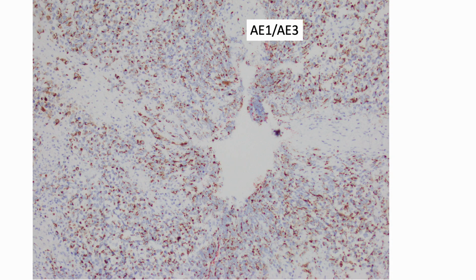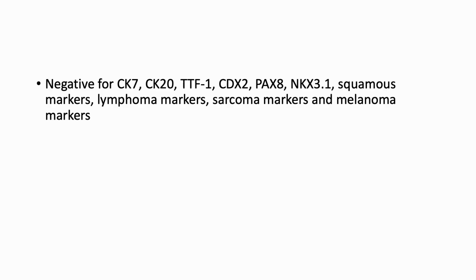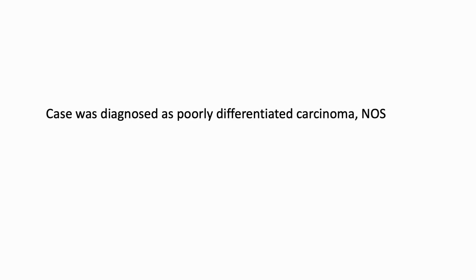This picture shows positive AE1/AE3 staining. We see perinuclear positivity with AE1/AE3. CAM5.2 is also positive, and showed a similar perinuclear staining pattern. The tumor cells are negative for CK7 and CK20. Transcription factors including TTF1, CDX2, PAX8 and NKX3.1 were negative. Squamous cell markers, lymphoma markers, sarcoma markers and melanoma markers are all negative. Based on these findings, the tumor was diagnosed as poorly differentiated carcinoma, not otherwise specified.